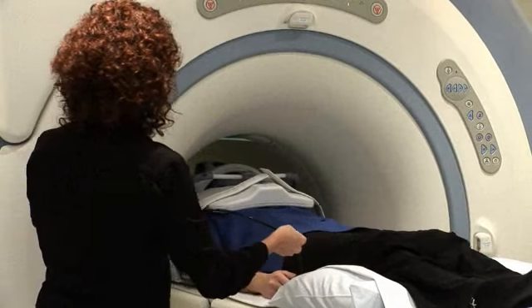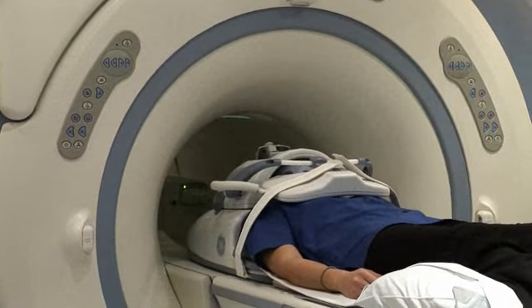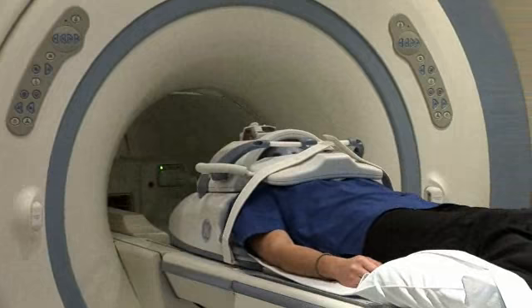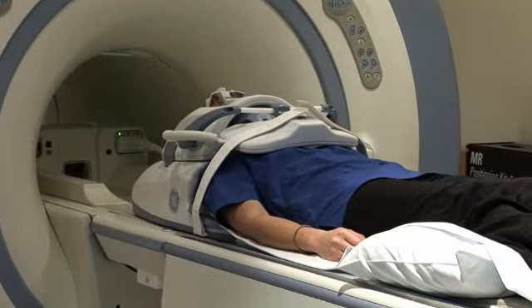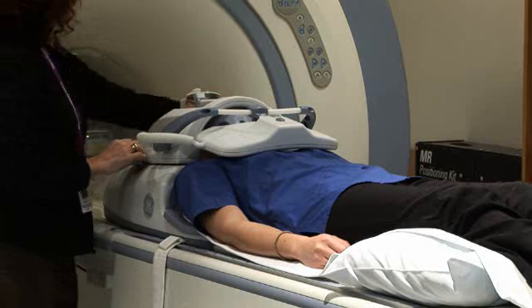The MRI has many advantages over other diagnostic imaging techniques. MRI systems do not use ionizing radiation and therefore have a very low incidence of side effects. MR has great tissue contrast. It has pretty good spatial resolution. It can be acquired in three orthogonal planes, but also multiple planes of obliquity.